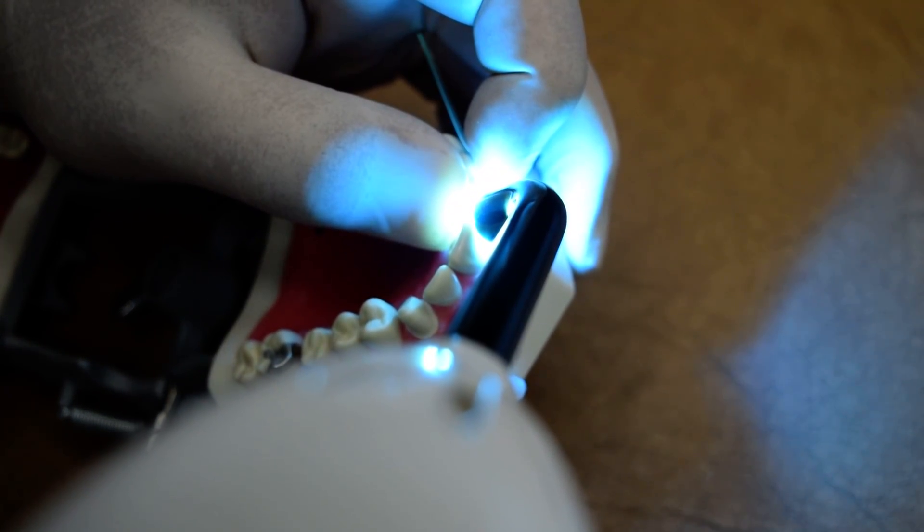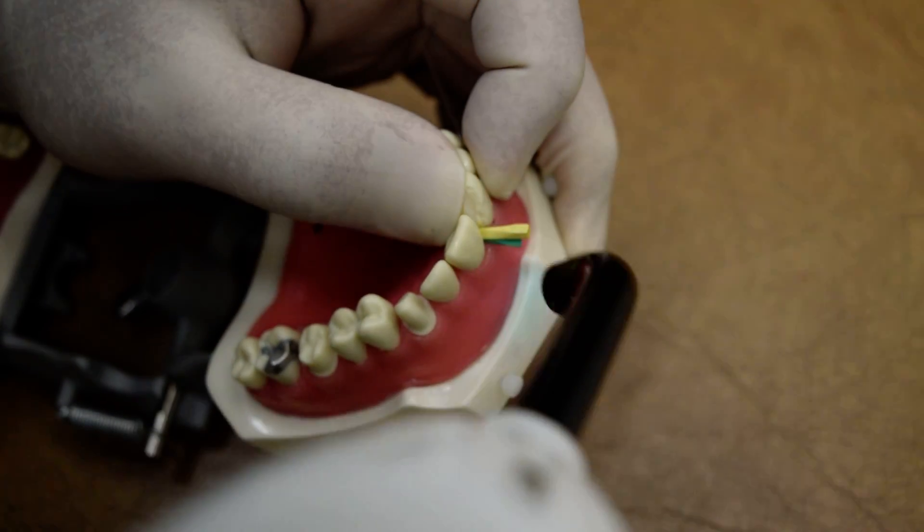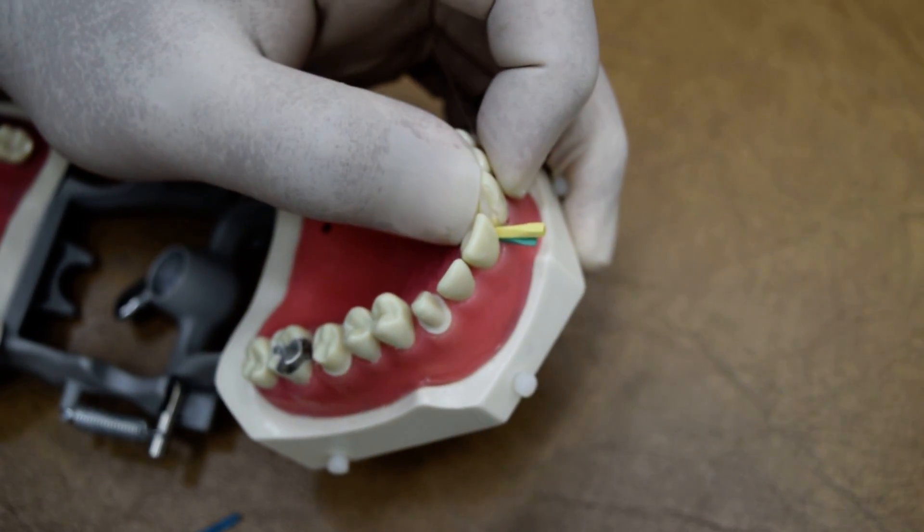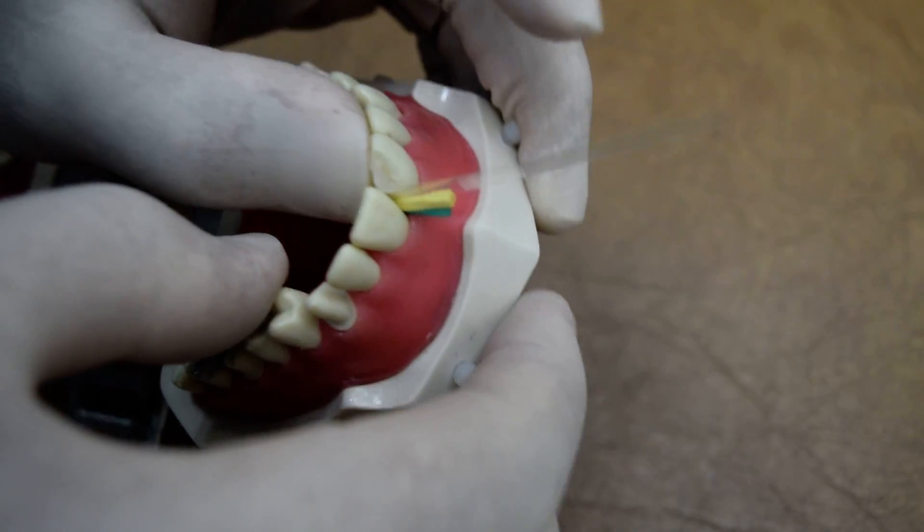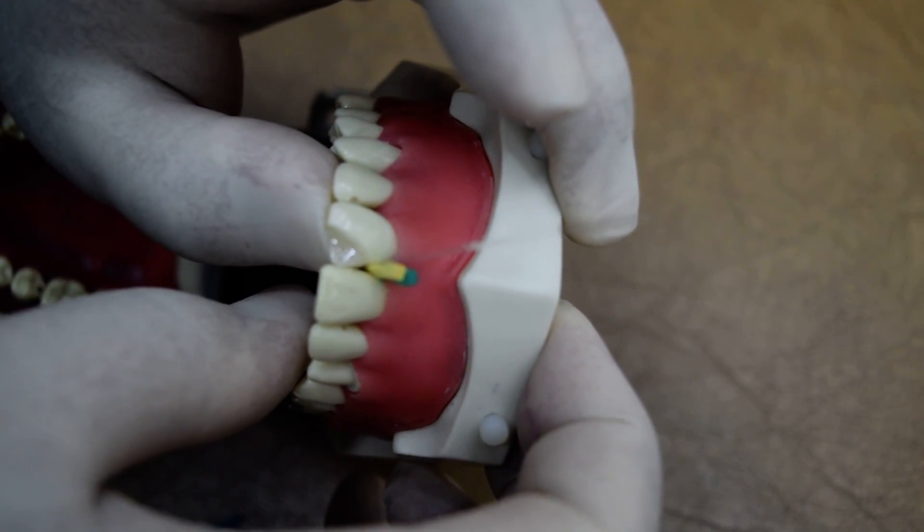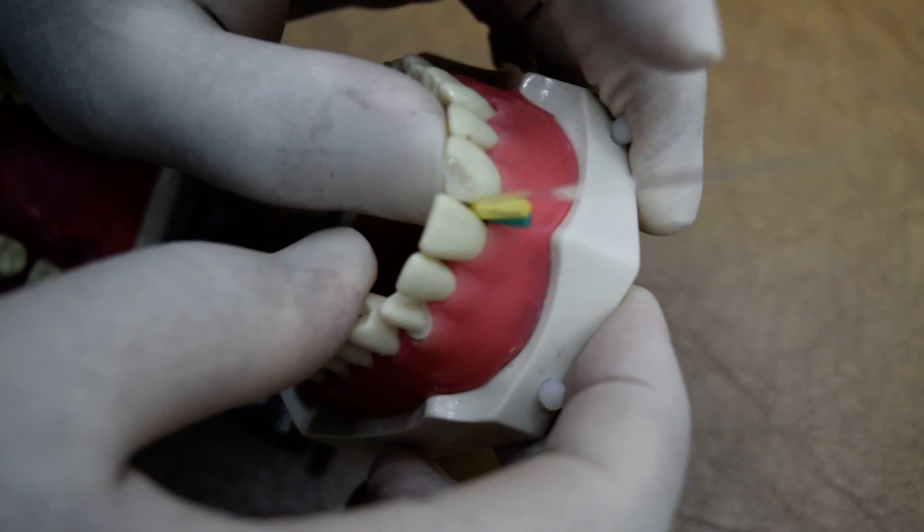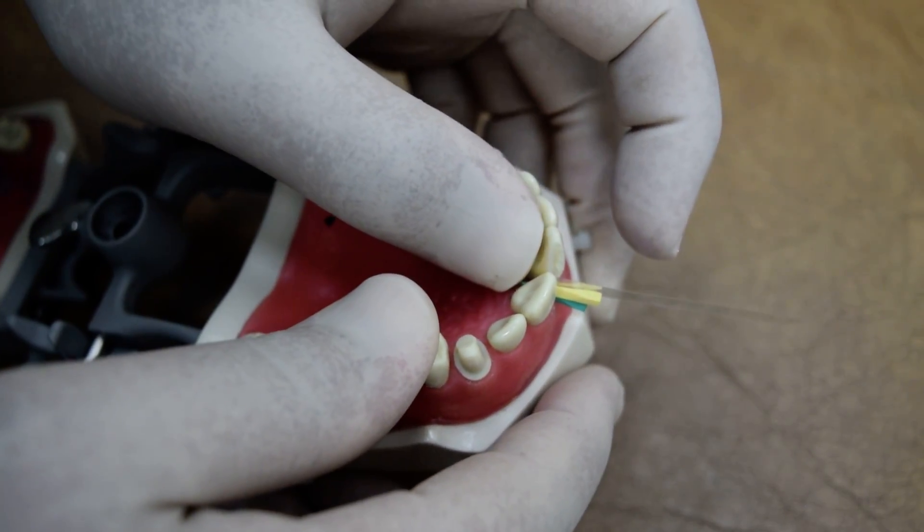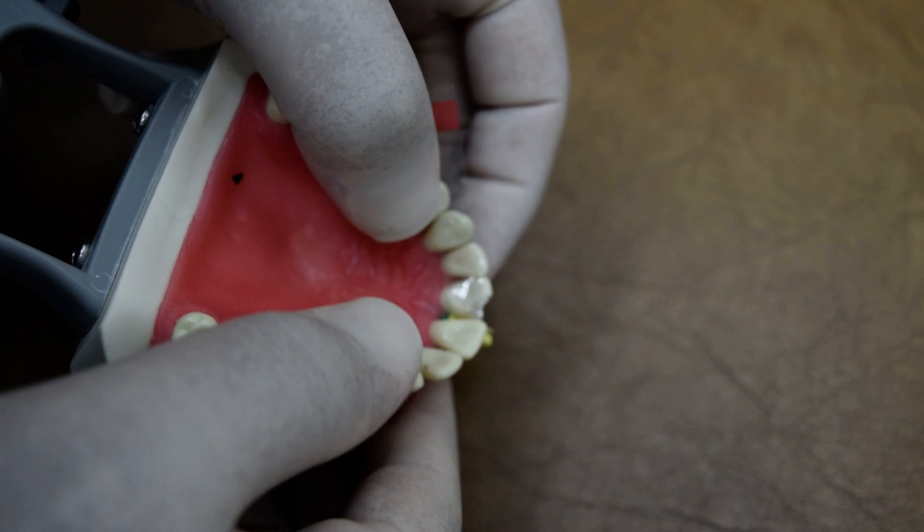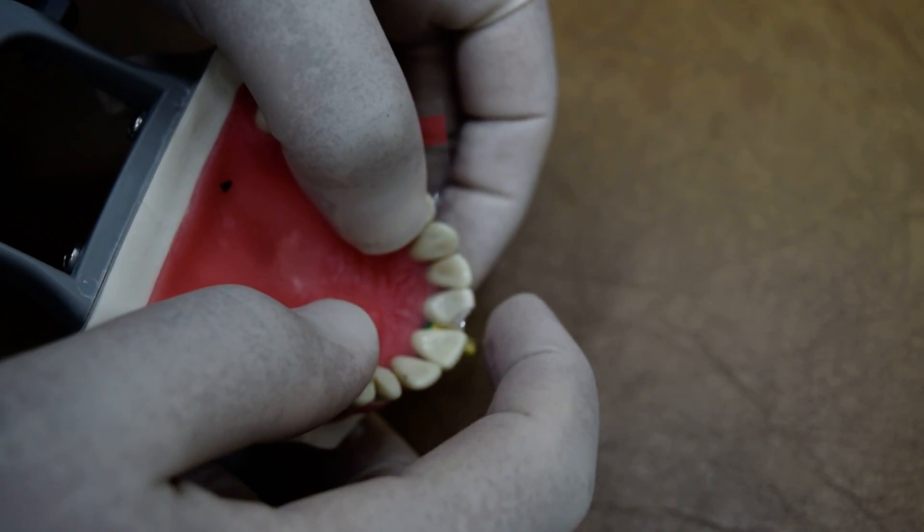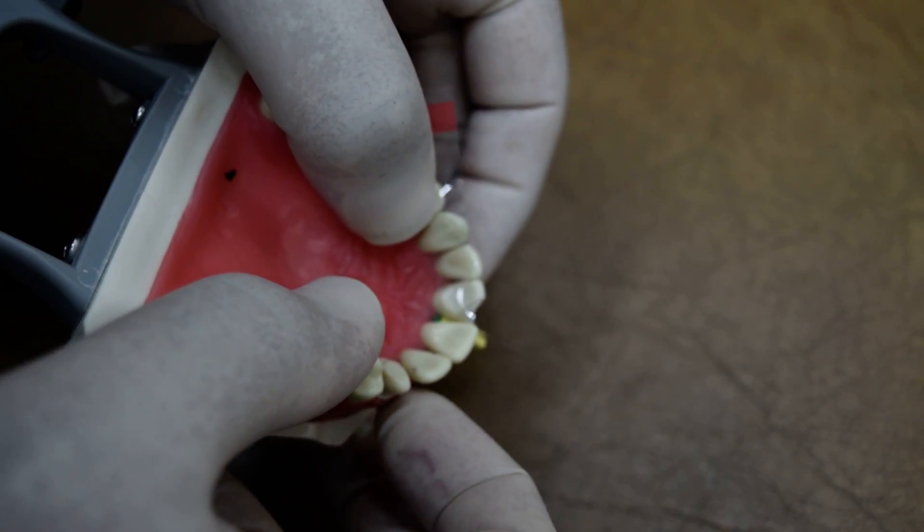This first layer should include the palatal surface and also part of the mesial surface. As you can see, the contact is already built and also the palatal surface, but incisally it's not yet done.